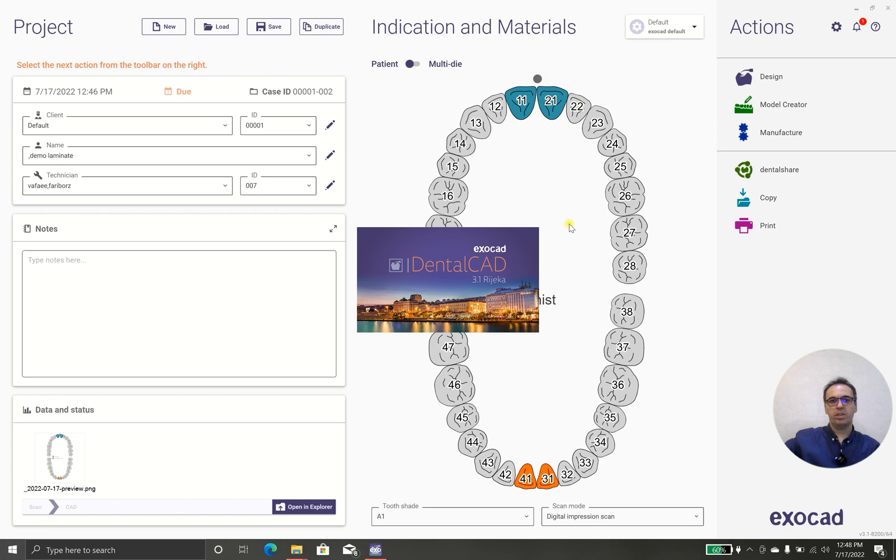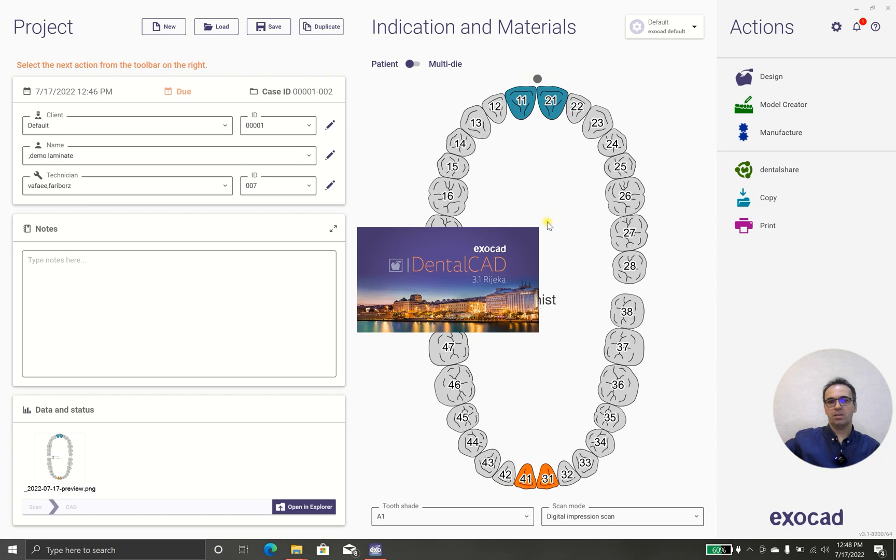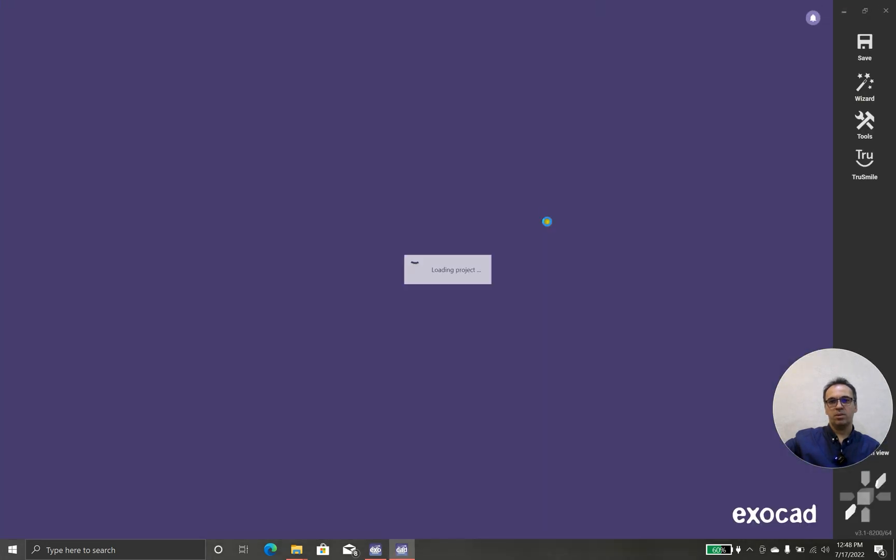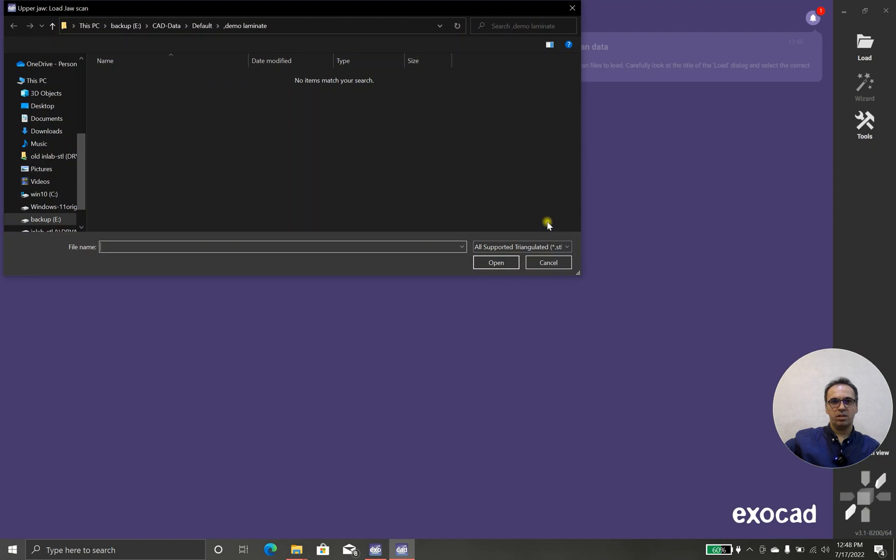We're waiting until the software runs. I think the last version was a little bit faster in terms of starting DentalCAD, but finally it's started.